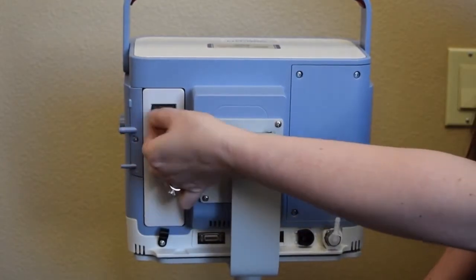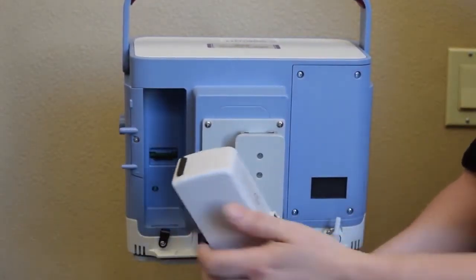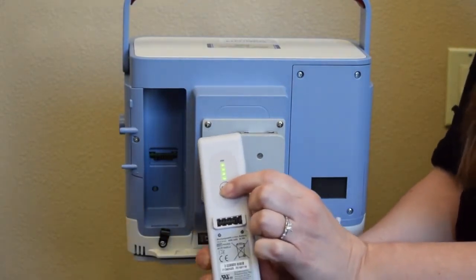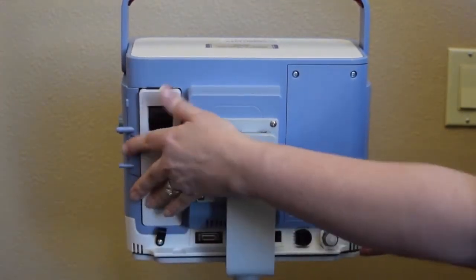For your back panel, you have your detachable battery. You lift up on the flap and pull the battery out. You can check the battery life by pressing the button. Your battery on a fully charged should last two to three hours and will only charge inside the ventilator.